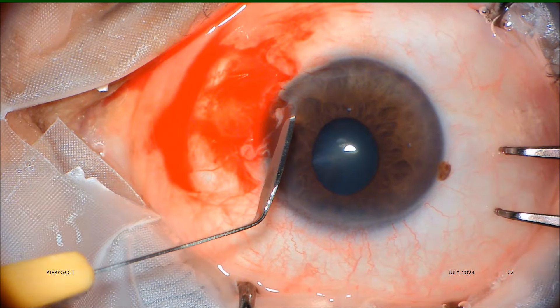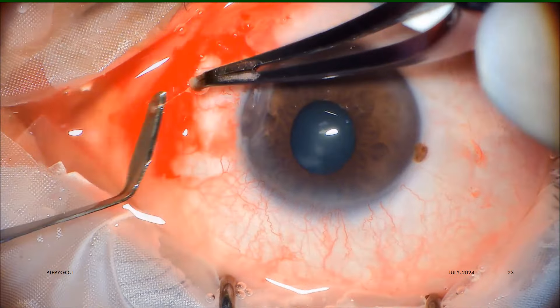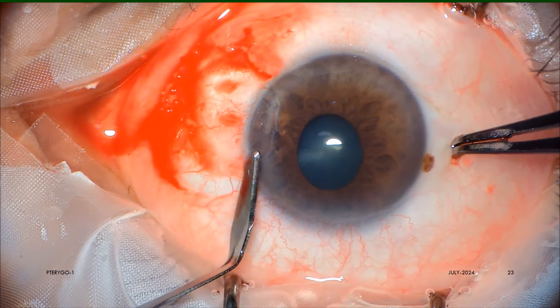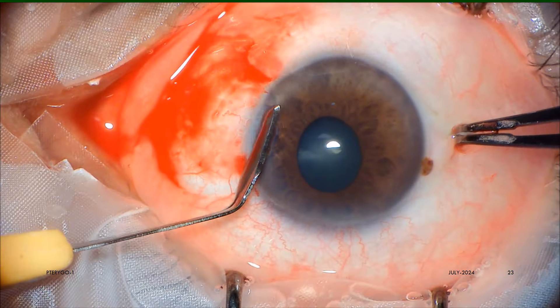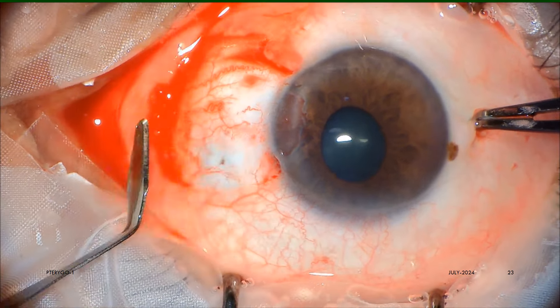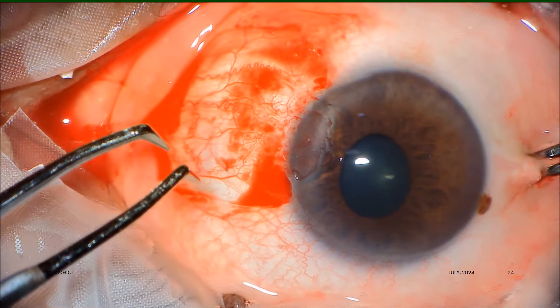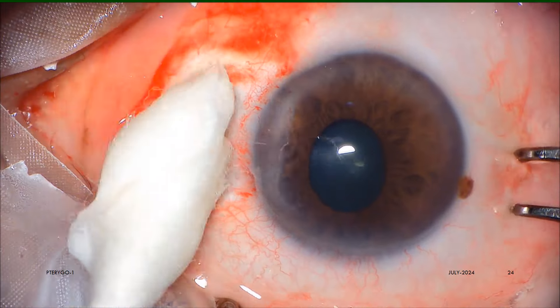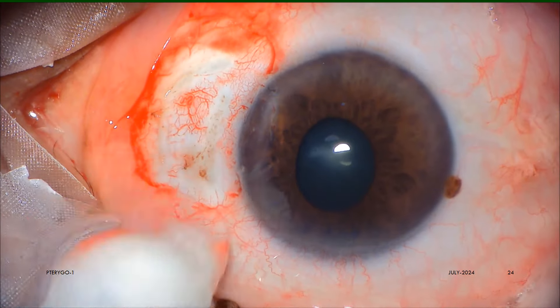Then the remaining tissue tags from the cornea as well as from the sclera are removed by pulling away or by scraping dissection, done with a crescent blade or a 15 number blade. Very gentle and mild low-power wet-field bipolar cautery is applied always under a film of water, and excess water is then dried by cotton-tipped or aero sponge swab.